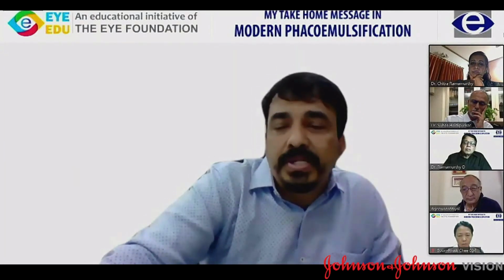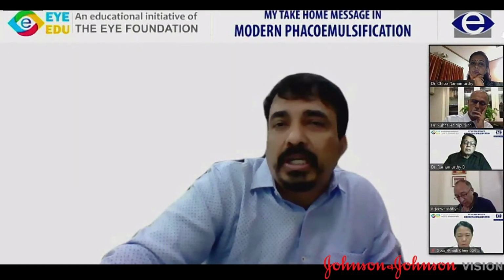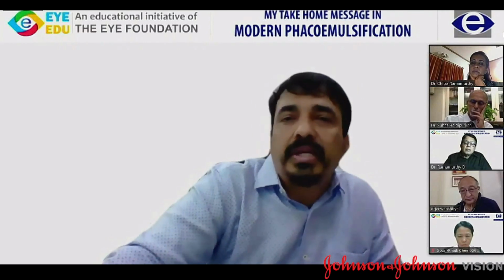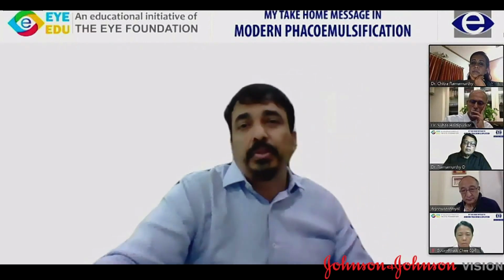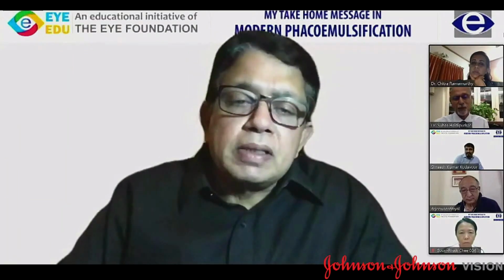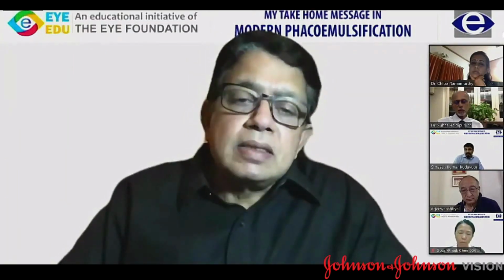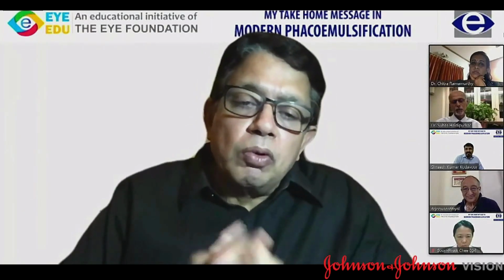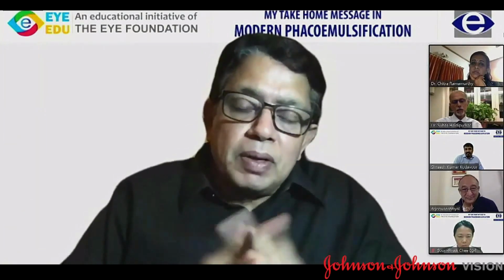So if the patient is willing to undergo a combined procedure, and understands the outcome, definitely we can plan this and do it together. Excellent. I think shall we summarize: if economics and convenience is a major consideration, then maybe combined surgery will be the way to go. But if refractive accuracy and premium intraocular lenses is what we are talking about, maybe splitting it in two phases would be a good way to go.